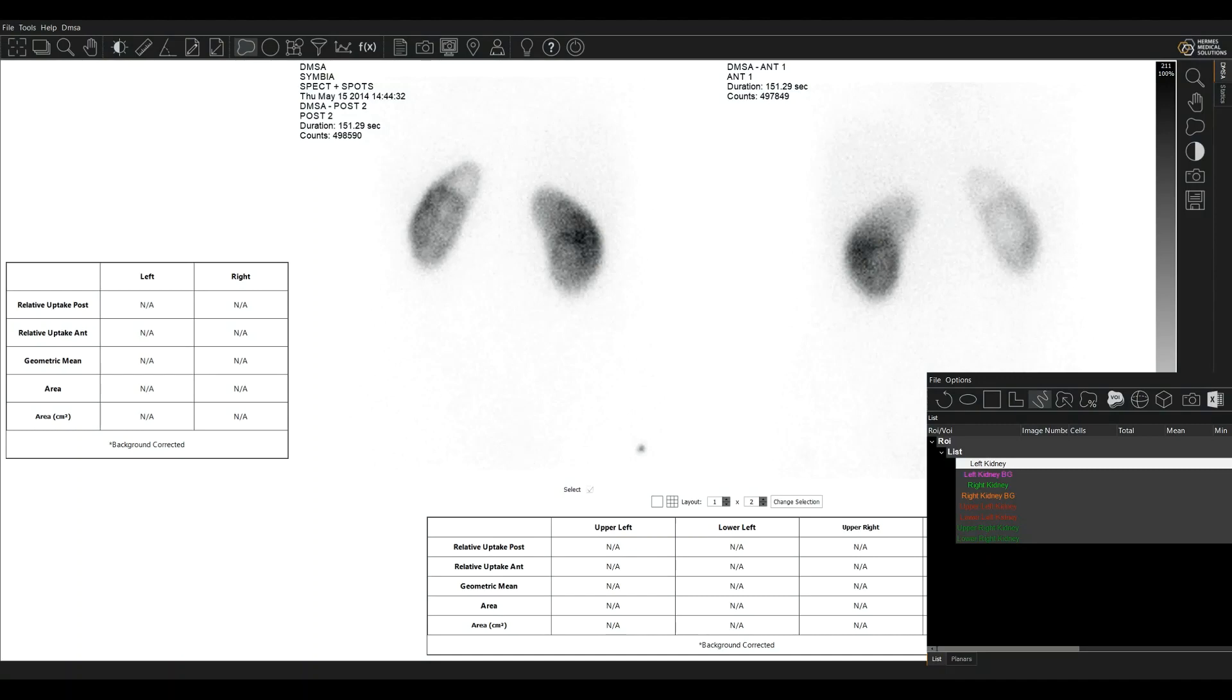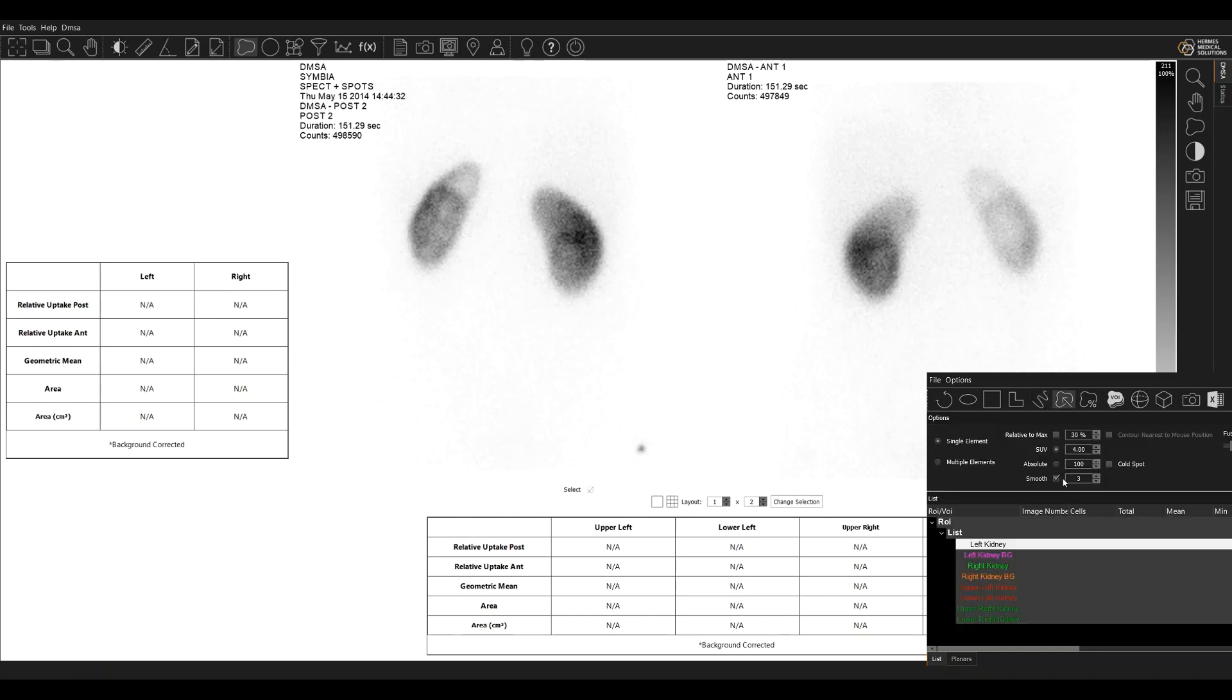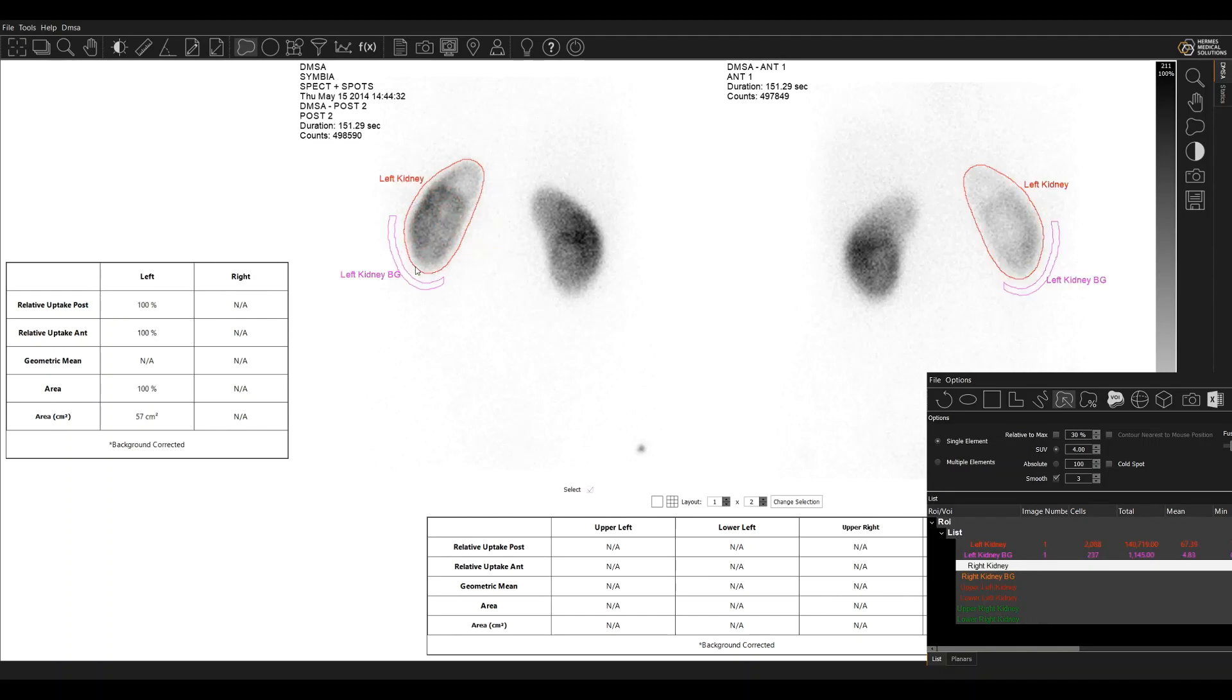We have loaded here an anterior and posterior DMSA scan. I'm going to start by drawing the left kidney. I'm going to use a seed ROI tool for that. So you click in a hot area and just drag to the edge and this left kidney region is made for you like this.